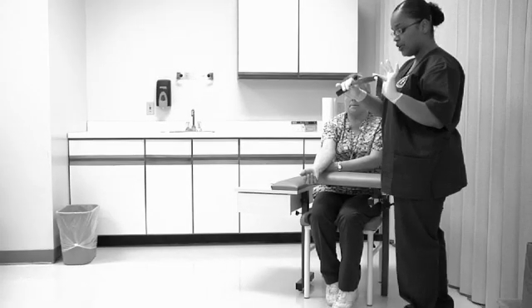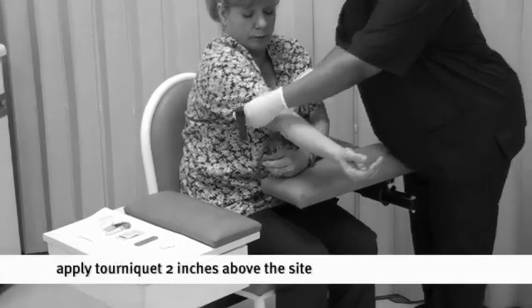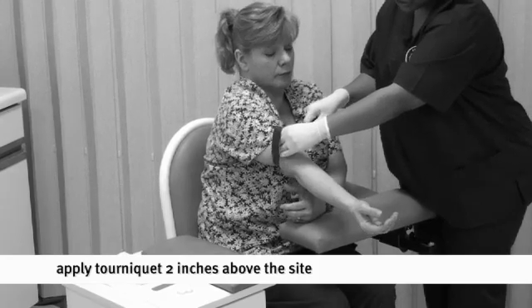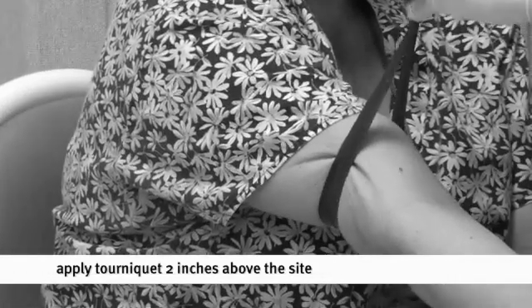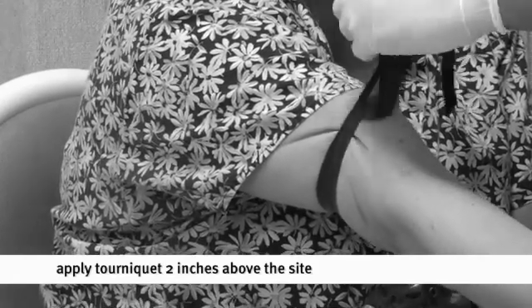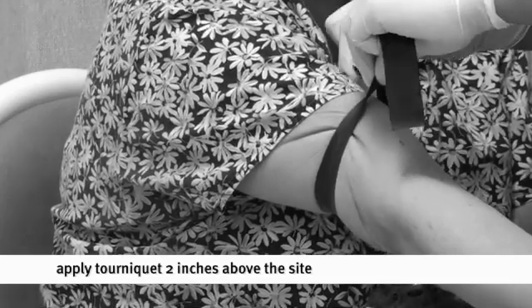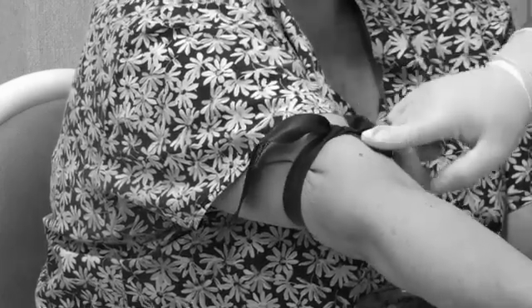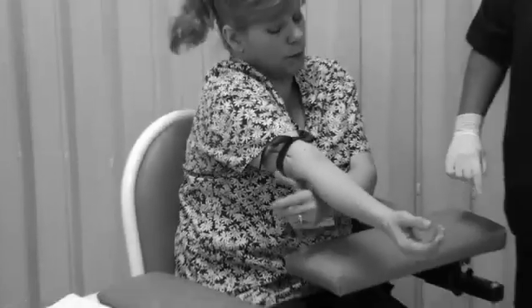Take your tourniquet and tie it roughly an inch and a half to two inches above the antecubital area. When you tie this, you don't want to tie it like a shoe — there's a trick to tying it. You stretch it as much as you can and cross it. Then take one of your flaps and stick a portion of it under the cross part. Now it's effectively tight. Ask the patient: is that too tight for you?